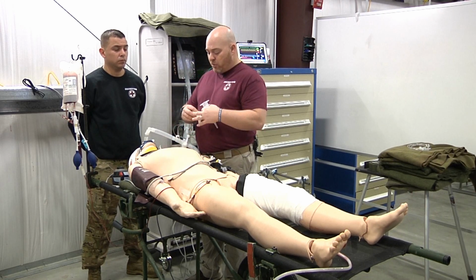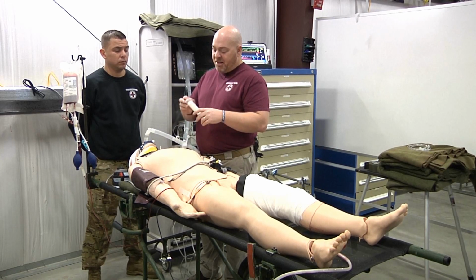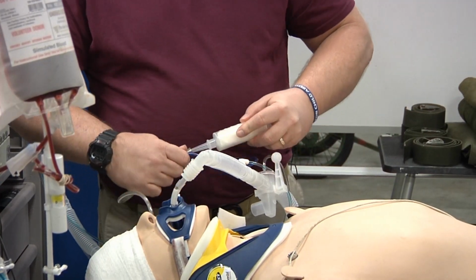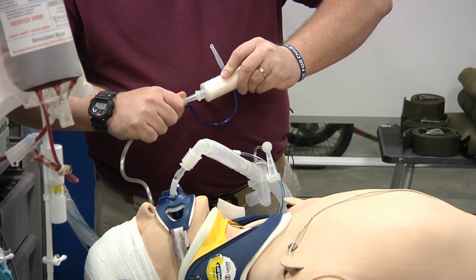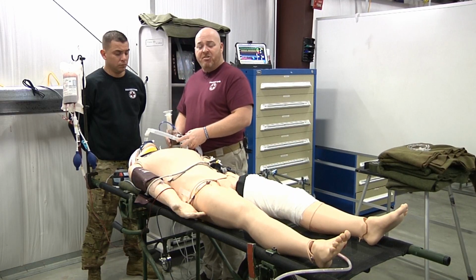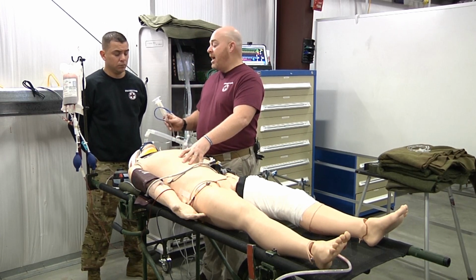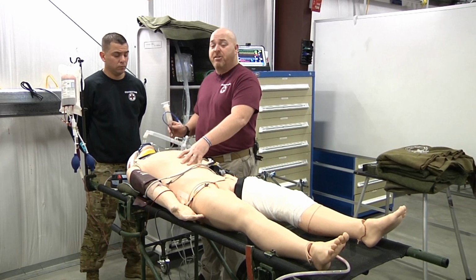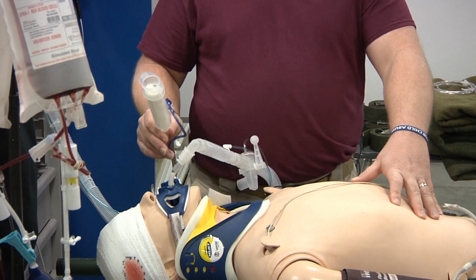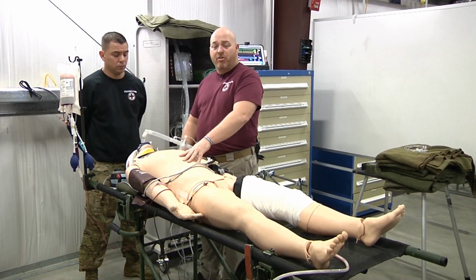We're going to take some 4x4s. We're going to place inside of our Toomey syringe, all right? And then we're going to cap it on the end of the NG-OG tube. Now what this does is it still allows gas to escape the belly to help with gastric distension, but also if we have any fluids, blood, vomitus, or anything like that coming up out of the belly, we'll be able to see color change in our 4x4 and let us know that we may have a problem. So again, that's just a good technique or good tool.